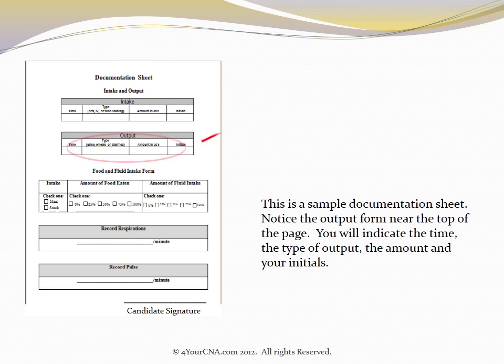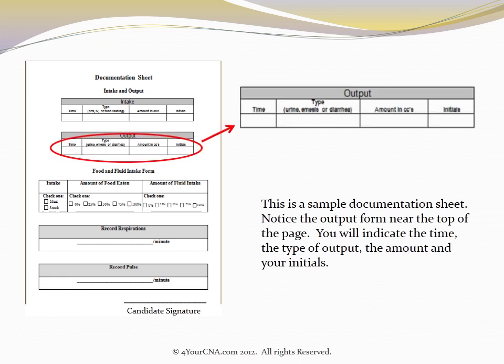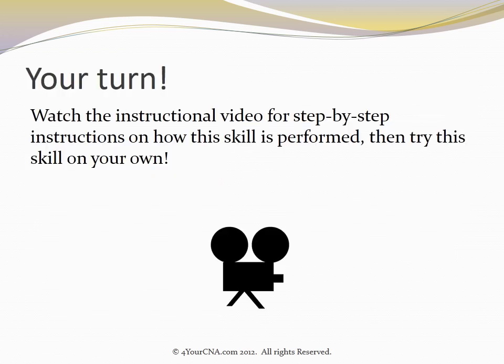This is a sample documentation sheet. Notice the output form near the top of the page. You will indicate the time, the type of output, the amount, and your initials. Finally, sign the form. Watch the instructional video for step-by-step instructions on how this skill is performed. Then try this skill on your own.